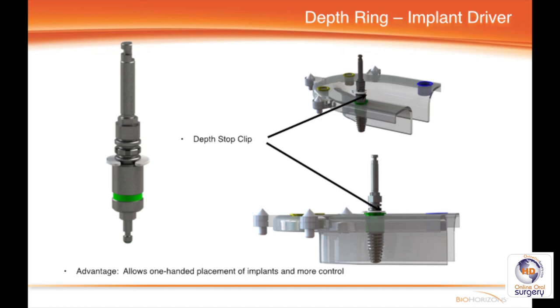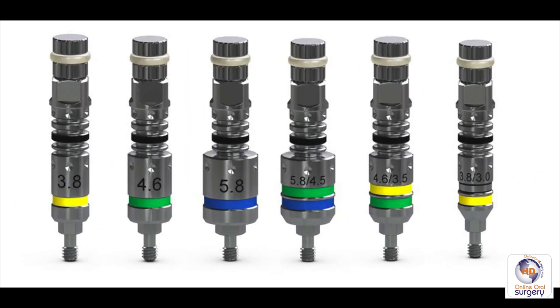during the procedure. In this case, I'm going to use the new screw-retained implant drivers, which you can see here are screwed directly into the implant fixture itself. There's a knurled knob on the end that is used to remove it after the implant's placed. And the square area just below is where the handpiece adapter attaches in order to deliver the implant. This is my preferred choice of implant driver to use when I'm doing an extraction with an immediate implant, because I can atraumatically remove this implant mount from the fixture without disturbing it at all.